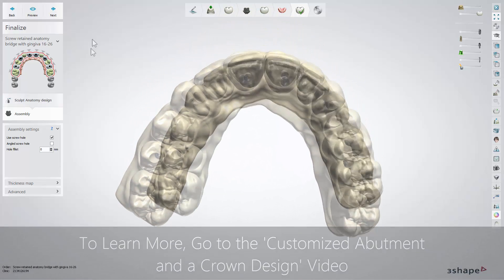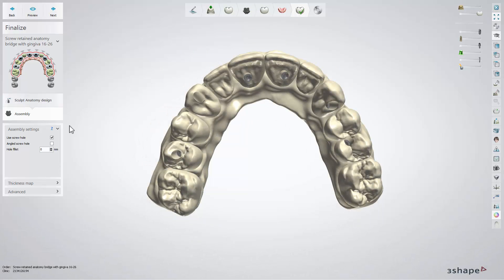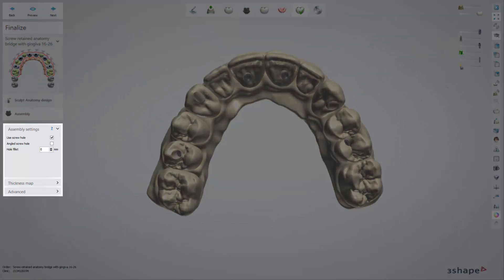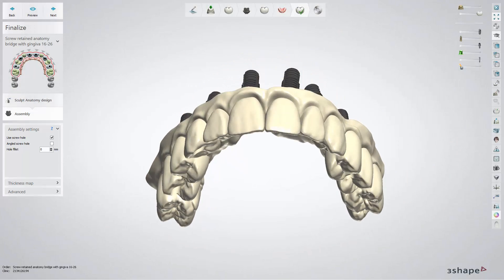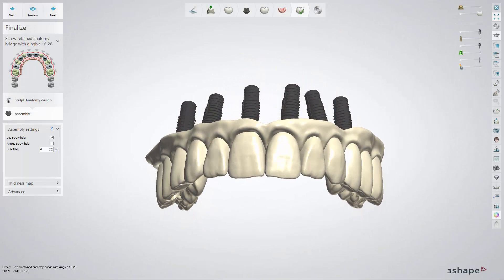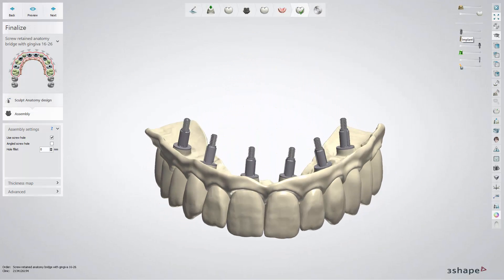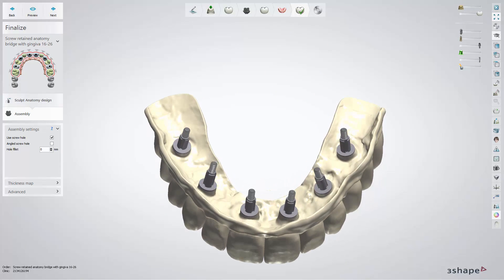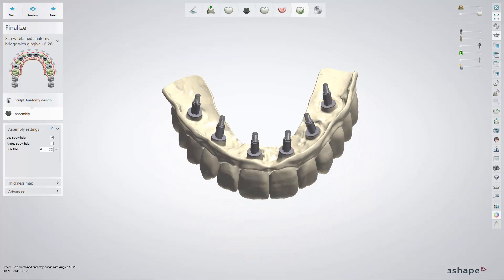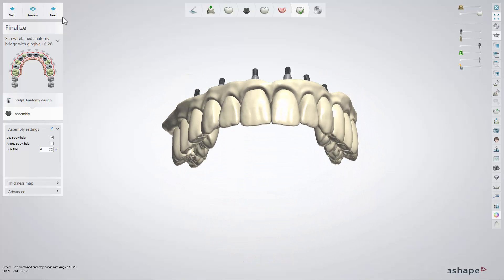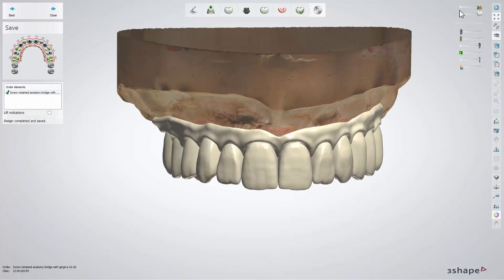Angulation of screw holes is possible at that step. You can also modify the Assembly settings here. When ready, click next and go to the Save step and then close.